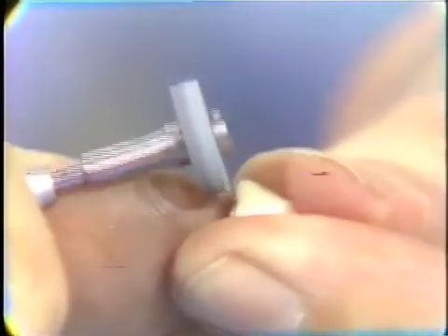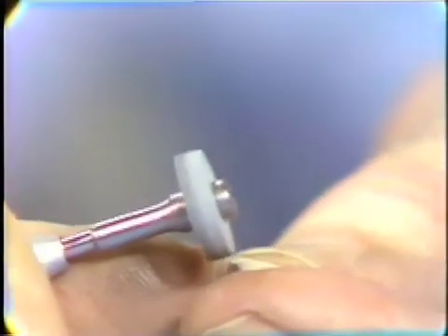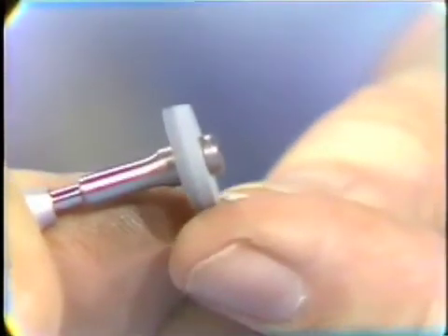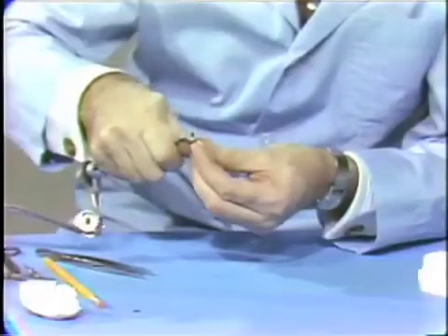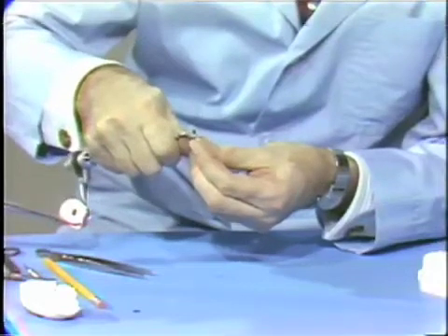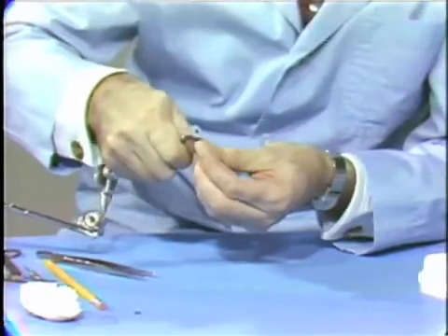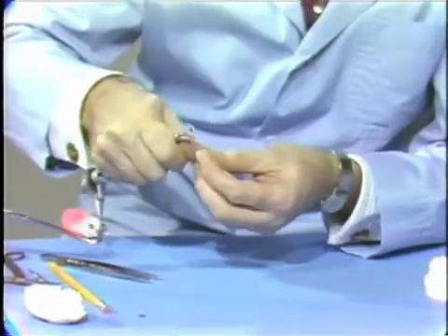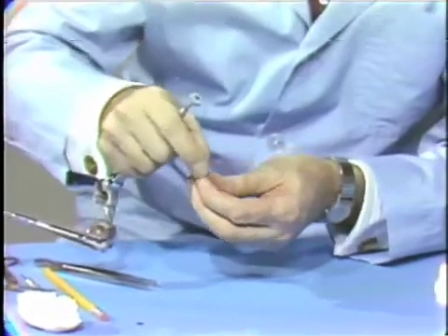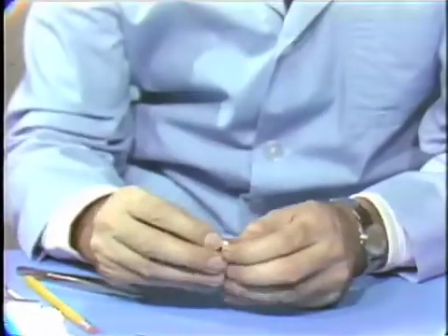Using the edge of a nice new stone, you can make slight adjustments to the overlapping metal edge here, just to cut it back so it is just level with the occlusal table of the porcelain pontic. All of this area is going to be covered by wax and, of course, ultimately by gold. So that now we have our occlusal table adapted on this situation.